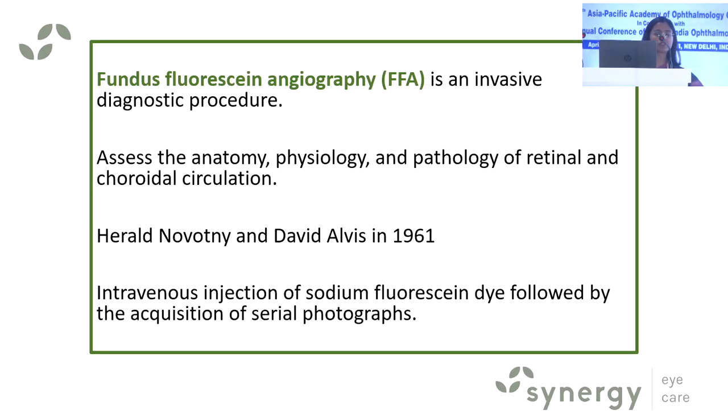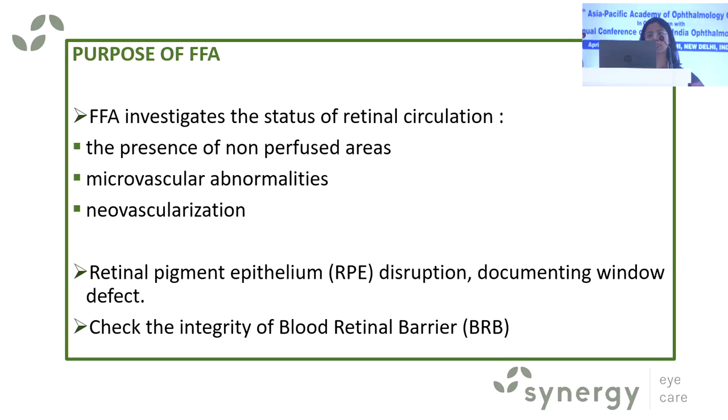So sodium fluorescein dye has the property that it cannot diffuse through intact retinal endothelium and retinal pigment epithelium. However, it can diffuse very easily through choriocapillaries, and these properties are used for diagnosing and detecting various retinal conditions.